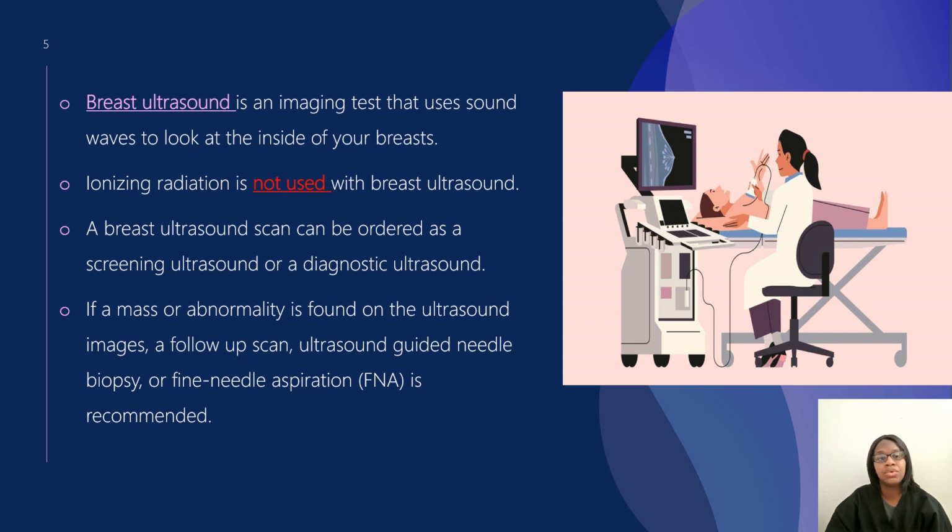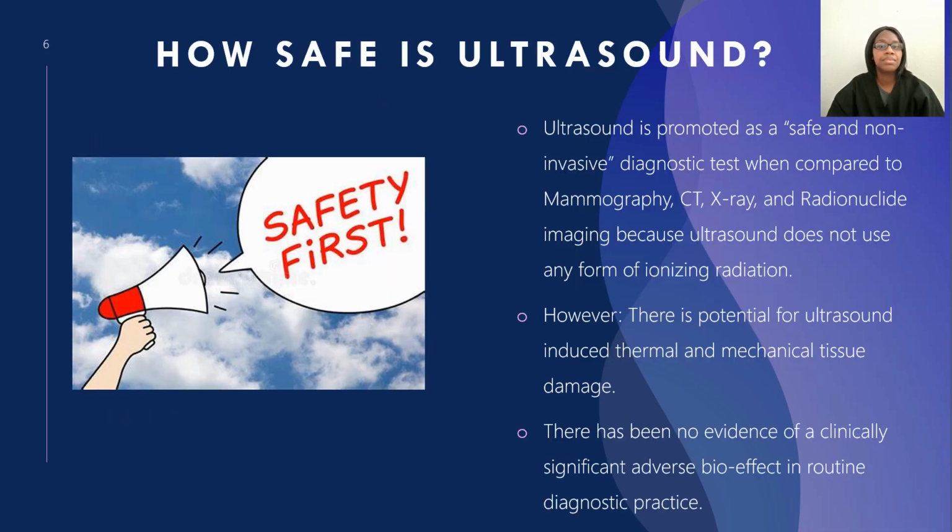So if a mass or abnormality is found on the ultrasound images, then the radiologist will probably recommend a follow-up scan, an ultrasound guided needle biopsy, or a fine needle aspiration will be recommended.